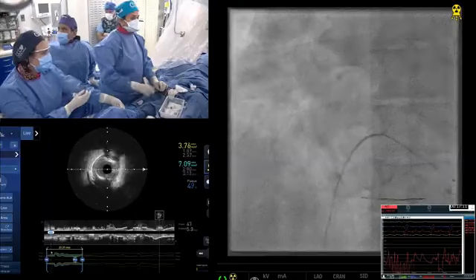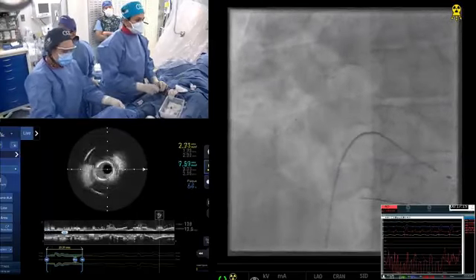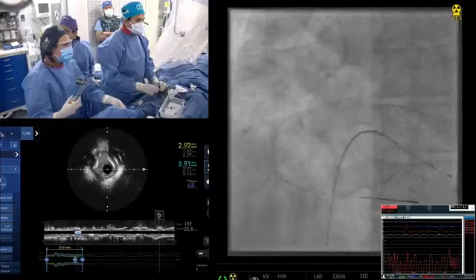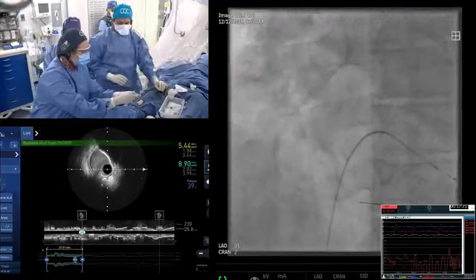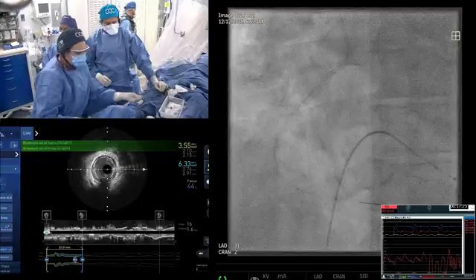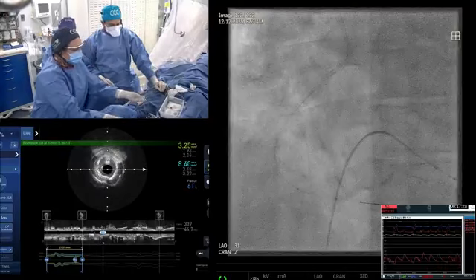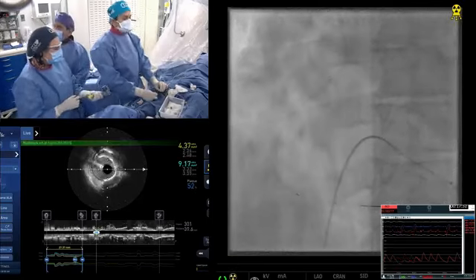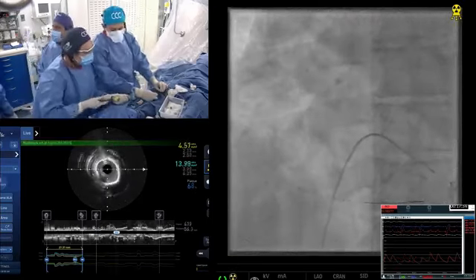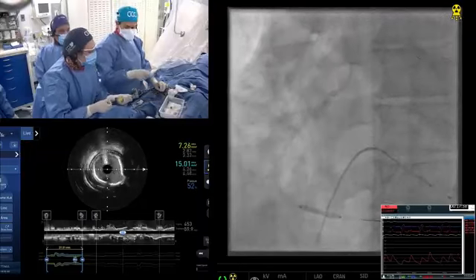Dr. Sharma, would you use low speed burring in such a situation before taking out the wire? I think a lot of people are talking about that. The low speed at 100,000, 120,000, that it works as an orbital atherectomy. I had not bought that concept. But I think we just go with the low speed, in the sense not of the 110 or 120, but 150. That to me, I think, is reasonable.